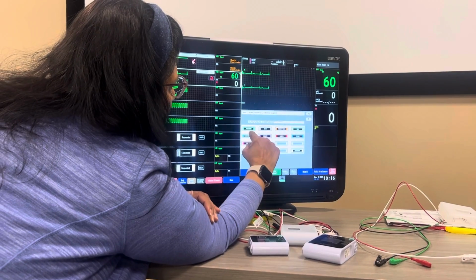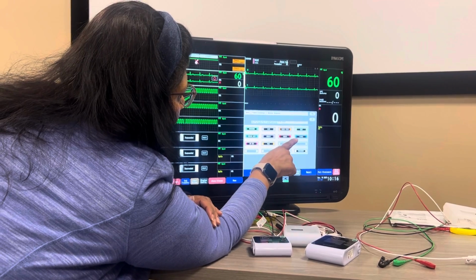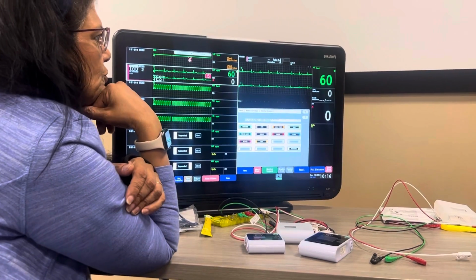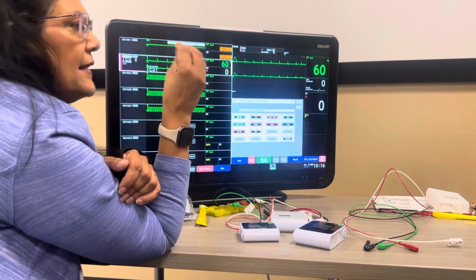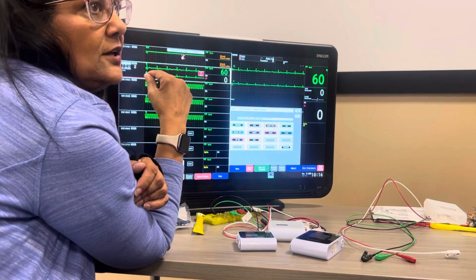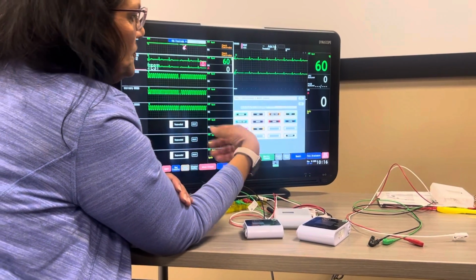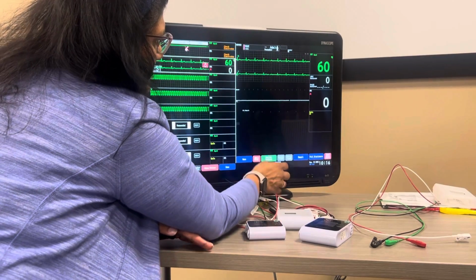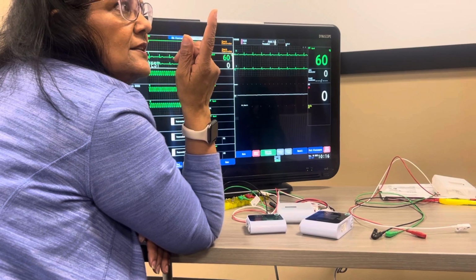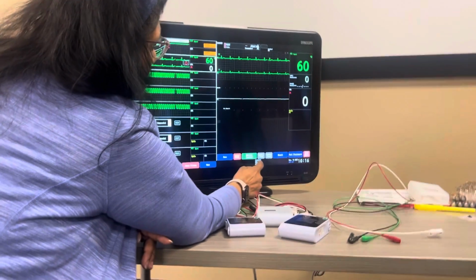What I placed in here was procedure, bath, family visit, x-ray, pending admit, surgery, cardio, CT, MRI, internal medicine, or walk. So whenever you take this dog out of the area of the ICU, you do want to suspend them, otherwise it's going to be alarming for somebody else. Okay, and it'll show the doctor where the patient's at too. What's the read distance? Like what's the perimeter? I have to see where the antennas are, but it's basically in the ICU area.